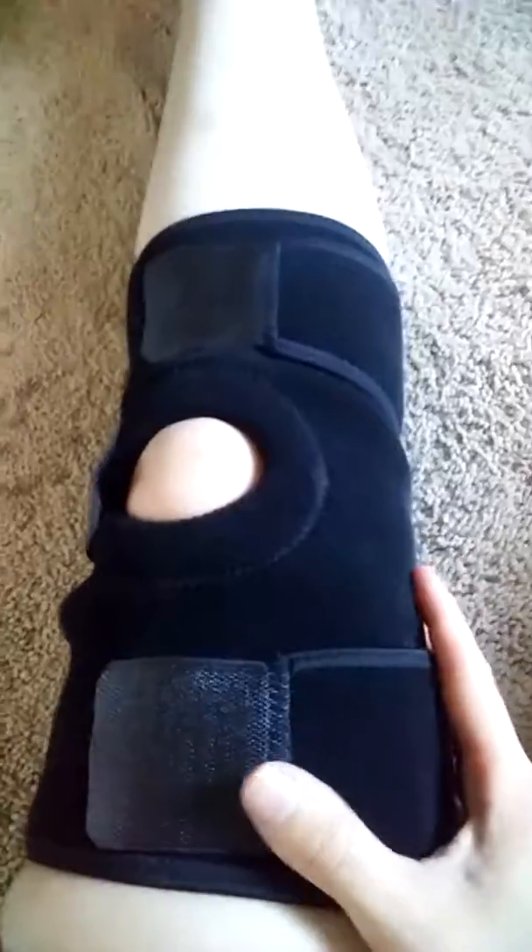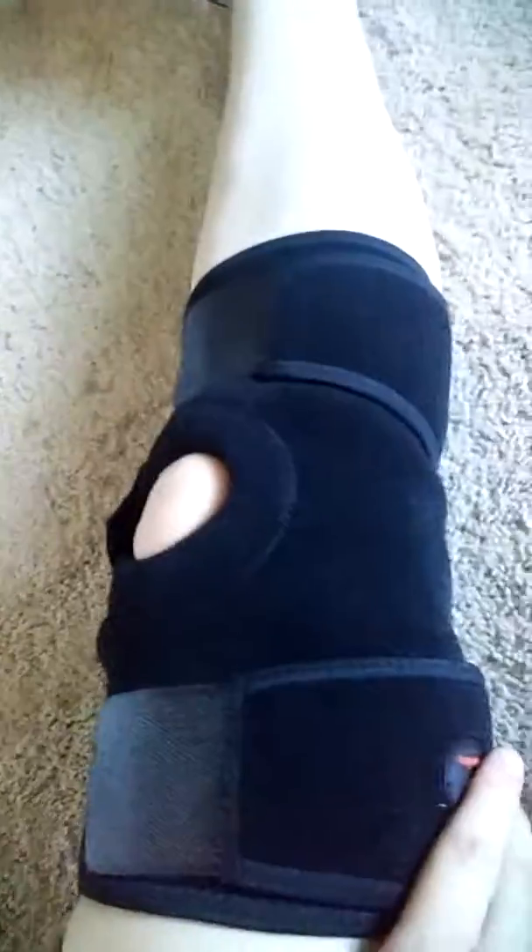This one fits pretty well. Mine is black. It has three velcro straps that wrap around in different directions, and it's a very soft material on both sides.